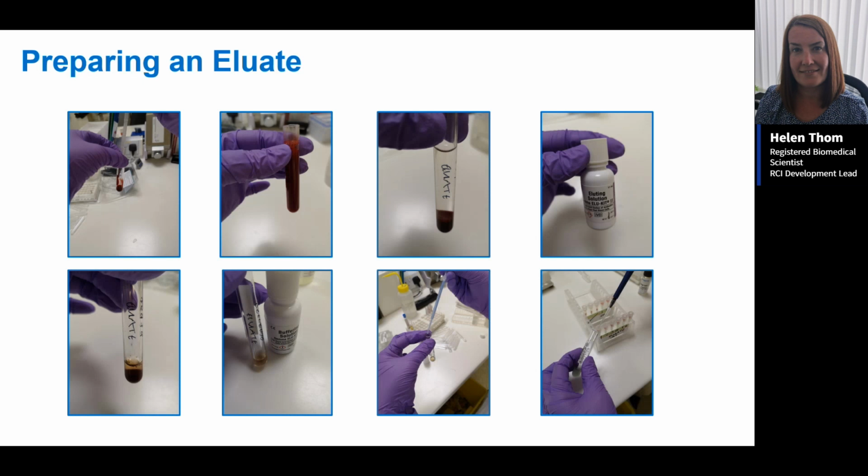Sorry, I can just see something in the chat there. What reagent is in the side of the IgM? Why do we use IgM for anti-Sera?